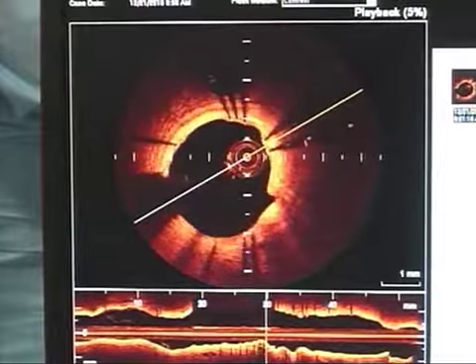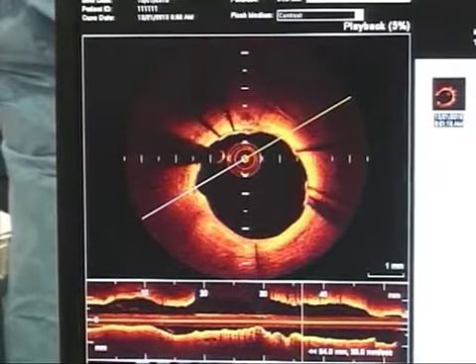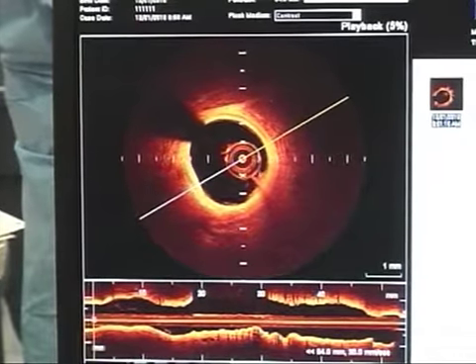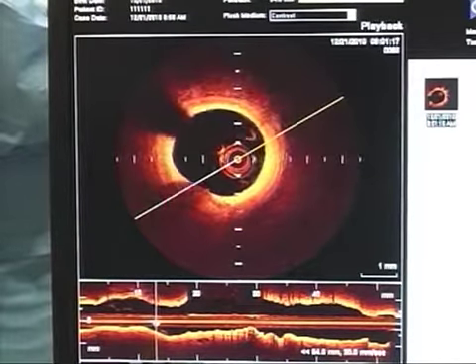You want to do some post-processing of the stent struts? No, she just showed the intimal hyperplasia. You can see it at higher magnification. The key is that it's a one shot. How many seconds does it take, 3 seconds? Yeah, in 1 second you see 5 centimeters. So it's an amazing speed. How much dye did you use there? 20 cc.